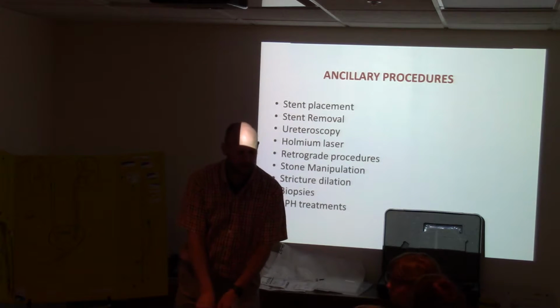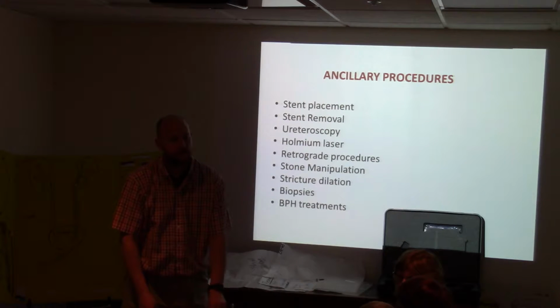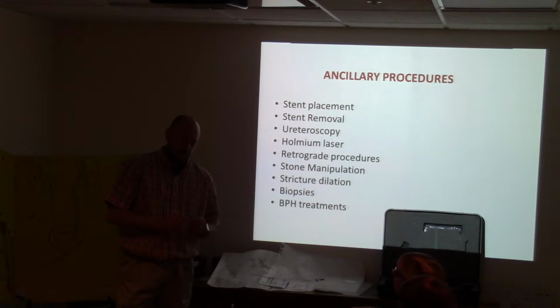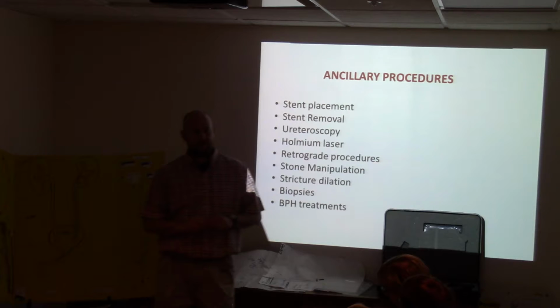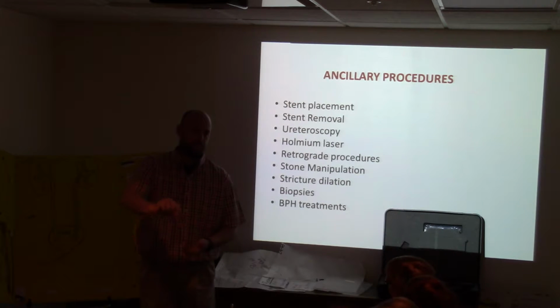I have a question for retrograde. Yes? Most of the time they use catheter, but how about injectable stent? Yeah, injectable stents, they're not used, in my opinion, as much as they should be. Because what a doctor will do is they'll stick a catheter up and a stent up. They don't teach it at teaching institutions as much as they should, because they like the repetitiveness of going up with a catheter, going up, doing things like that, instead of getting it done in one shot.